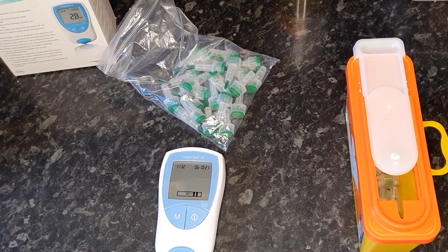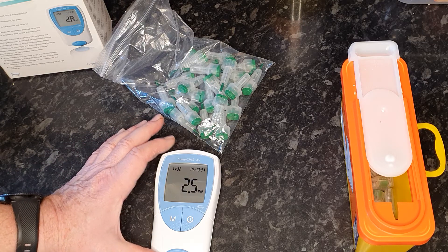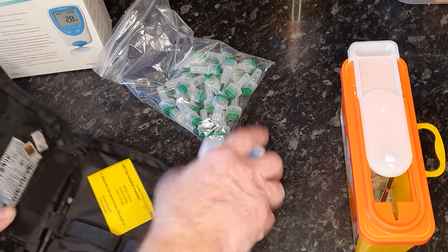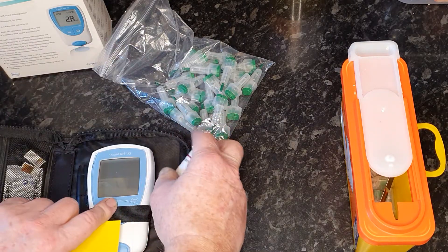Then it'll tell you your INR for that day. Sometimes you seem to be waiting a little longer than others. 2.5 — which is absolutely on the nose for mine. My range is 2 to 3 and 2.5 is perfect. So then you remove the strip, put that in the container, turn the CoagCheck off, and then I dial a number to tell the INR clinic that my INR was absolutely on the ball.